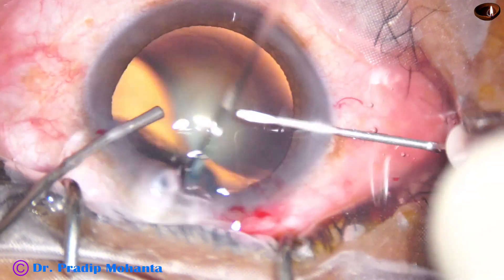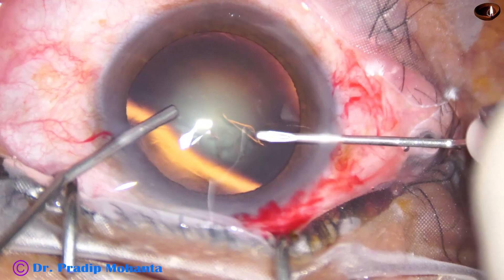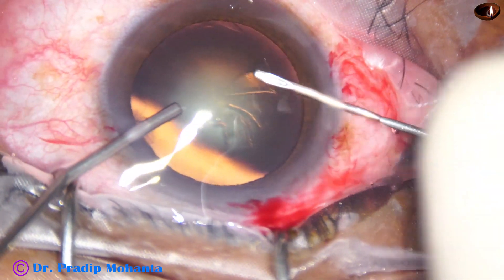All the incisions are on the posterior aspect of the limbus, which is very good. Healing is much better when you make the incisions on the posterior aspect of the limbus.